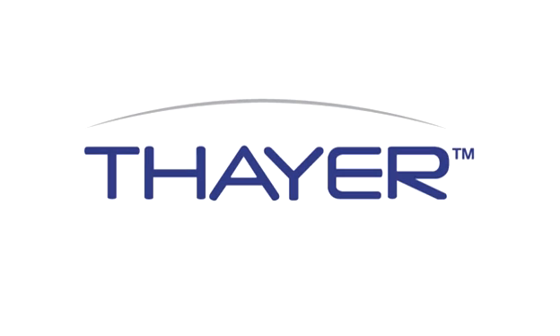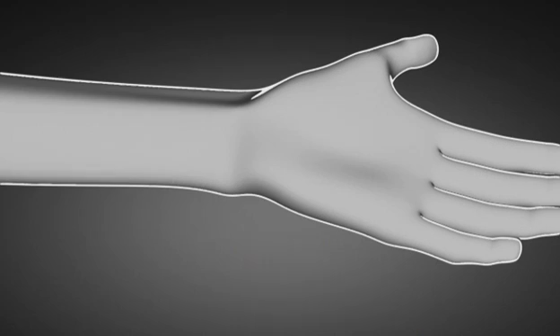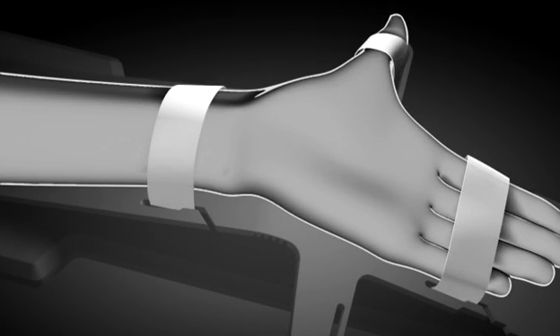Thayer presents the Manos Incisionless Carpal Tunnel Release. The patient's arm is placed in extension and secured to the Manos handboard.